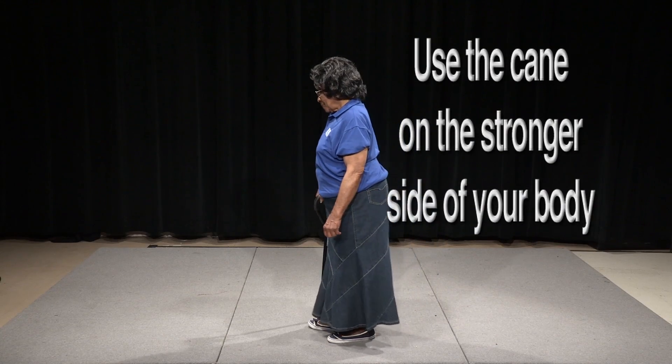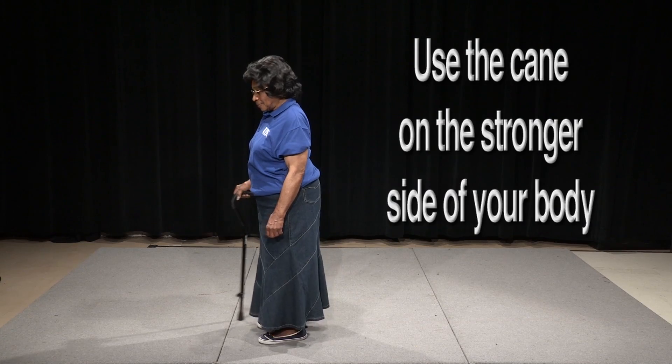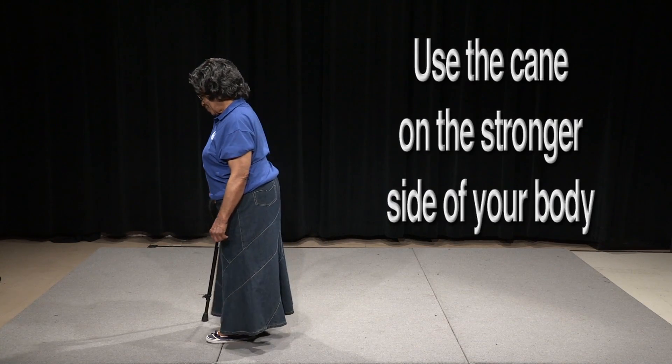Be sure to use your cane on the stronger side of your body. You can use these same instructions if you have a straight cane or a quad cane.